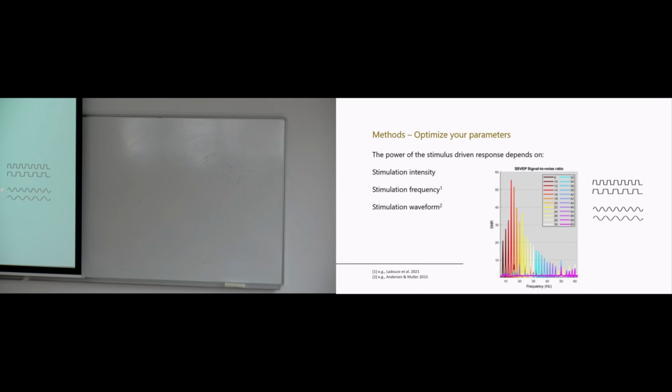You can also go with different forms of stimulation. In visual frequency tagging, it's a bit difficult to do that with the computer. But if you have photodiodes, for example, you can feed them a sine wave, so you have a smoother way of stimulating.